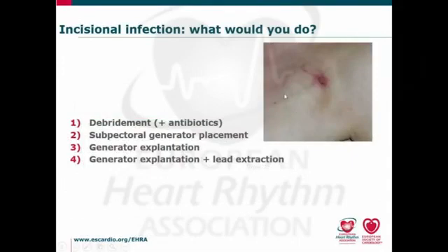Okay, this is another case. This is a patient who's had a previous pacemaker, and he's had a recent box change. The wound was not healing properly. There's this inflammation around there. So what would you do here?